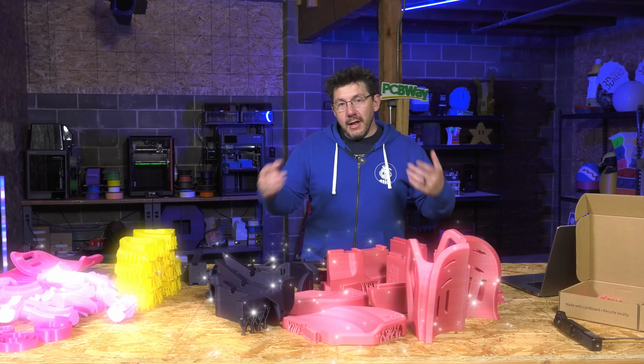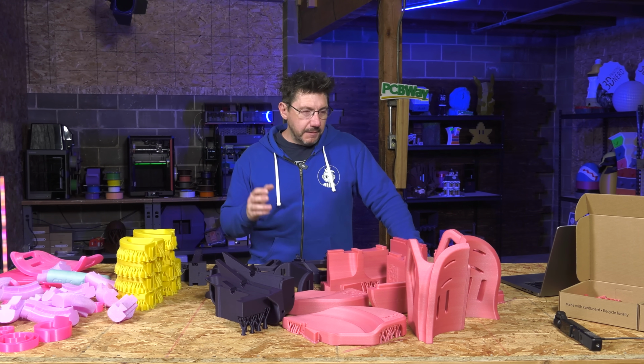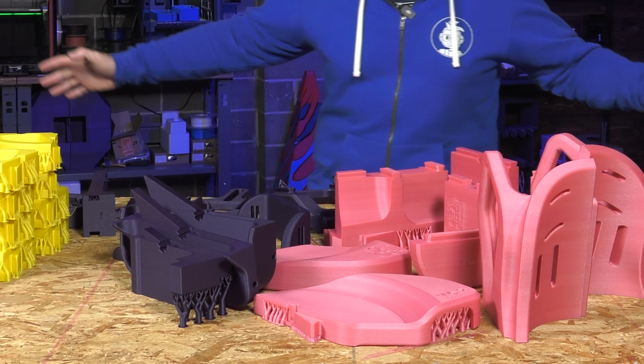And now I have another one to assemble for a young little girl named Siobhan, and she likes these colors. And so I'm gonna take you through the process of building it rather than just time-lapsing all of it.